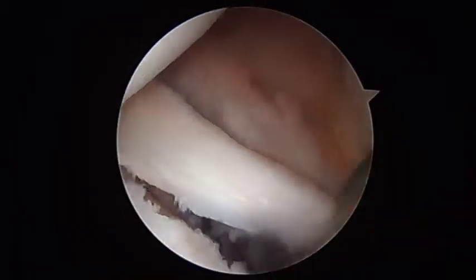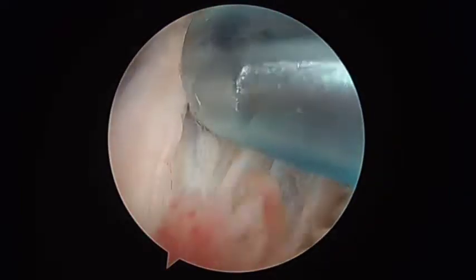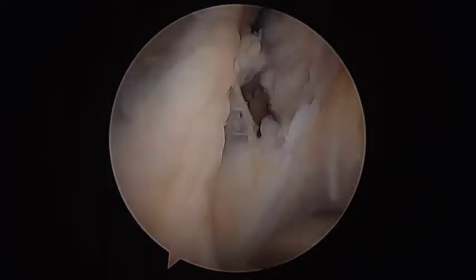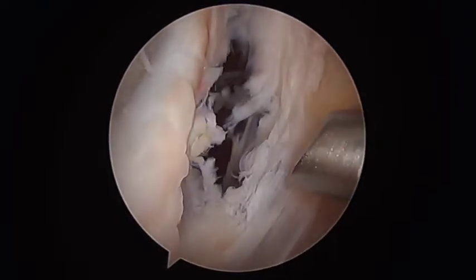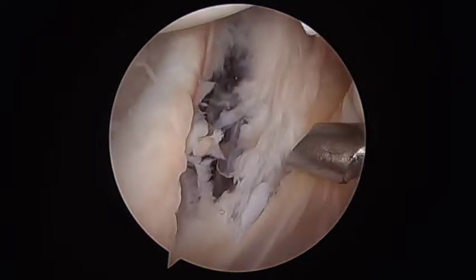A standard posterior viewing portal was established, followed by the establishment of an anterior-inferior rotator interval portal via an outside-in spinal needle technique. Diagnostic arthroscopy was notable for intact cartilage surface of the glenohumeral head. The labrum was inspected. There was a Bankart tear noted from the 6 o'clock to 12 o'clock position. The posterior labrum was found to be intact.